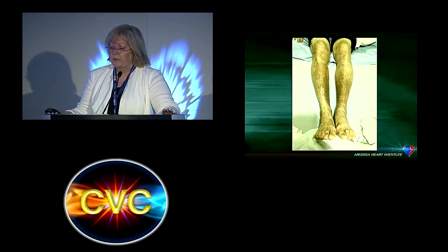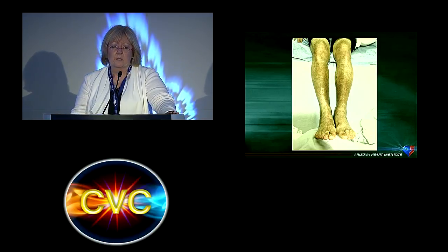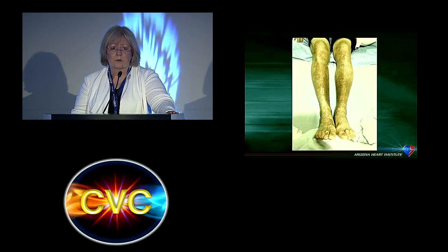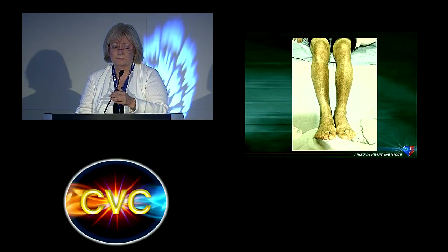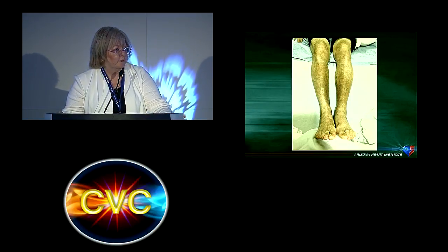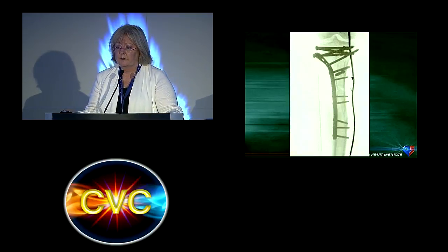This is what his legs look like after we have opened up his IVC for the last 4 years. His IVC iliac stents are open. So great improvement by just removing the obstruction. But his valves are damaged. He does not have diastolic dysfunction. He is not obese, but his valves are damaged significantly.